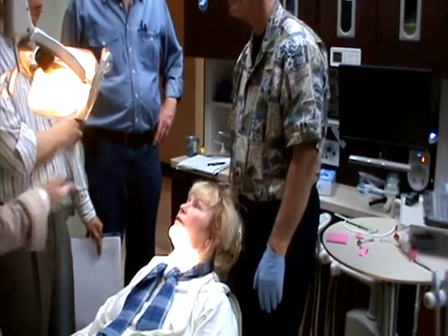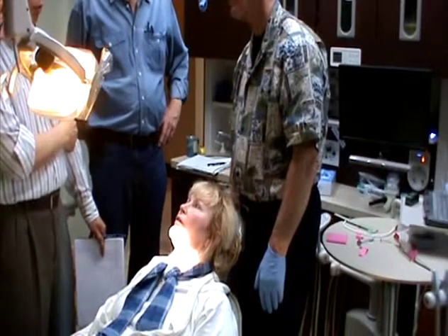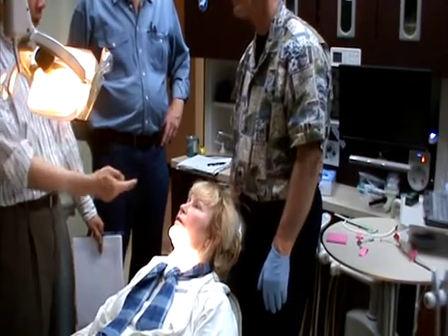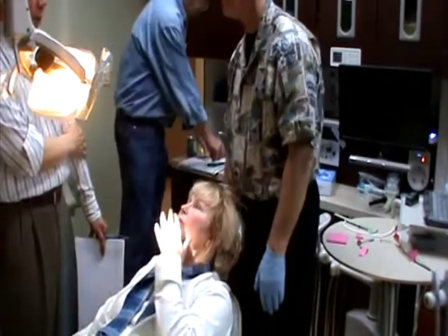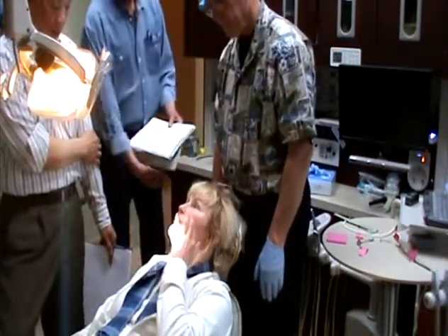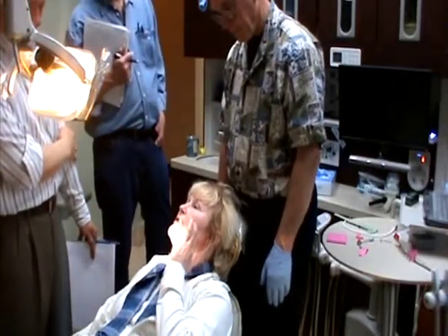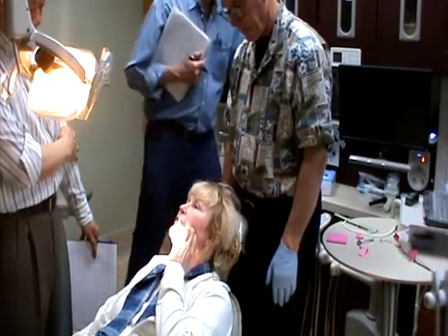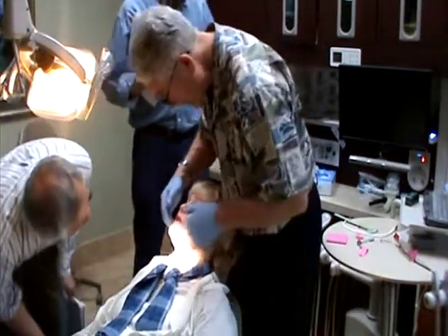Well, the old plastic appliances we used to try, the Schwartz with a single screw, it just expands out the externally rotated side more. Because if you look, isn't this side out pretty far? I expanded with a nail before. When you look at my, do I have room for expansion?